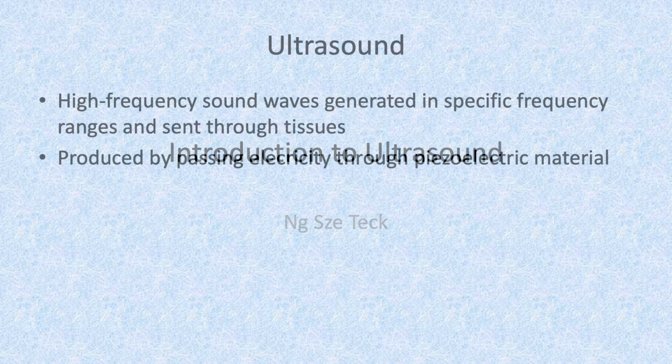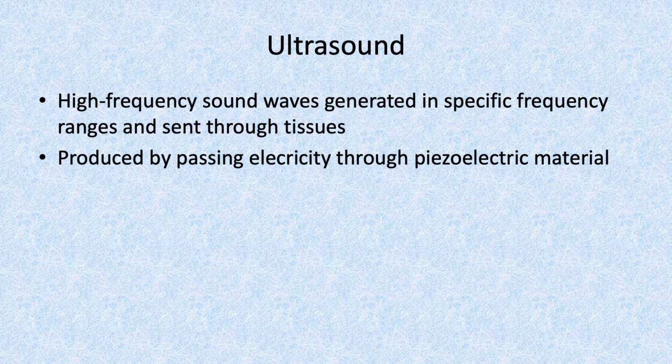Alright, so what is ultrasound? It's basically just high frequency sound waves. It's produced by electricity passing through piezoelectric material. We utilize this ultrasound, transformed into images, so that we can view structures like veins, arteries, nerves, muscles.